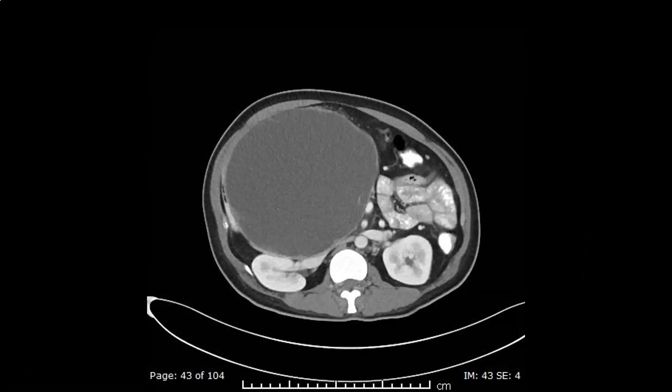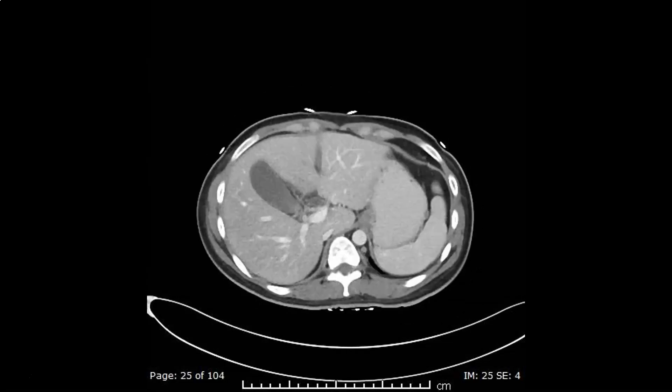CT has been performed to determine the organ of origin and, if possible, the nature of the lesion. From the first look, it is not easy to do that. We have to analyze very carefully the anatomical relations and displacement of certain anatomical landmarks to know the exact organ of origin.